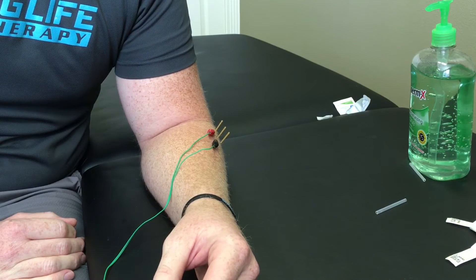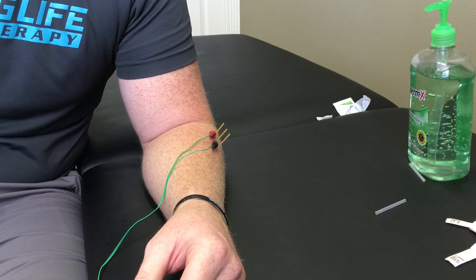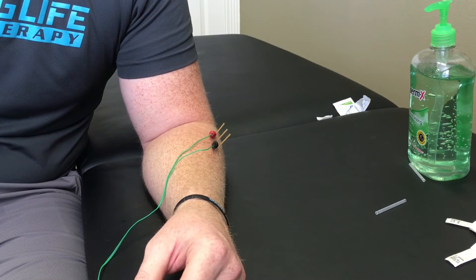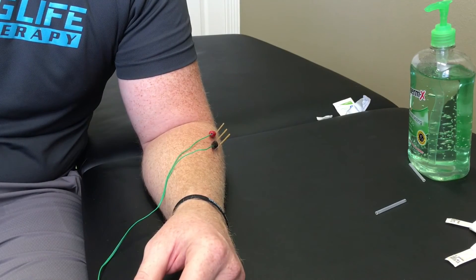I usually leave the needles in place for about 15 minutes and let them work their magic. Dry needling works by causing tight muscles to release. It also releases natural pain-relieving chemicals in the body. You get an increase in blood flow and a small inflammatory response, which brings cells to the area to help accelerate the healing process.